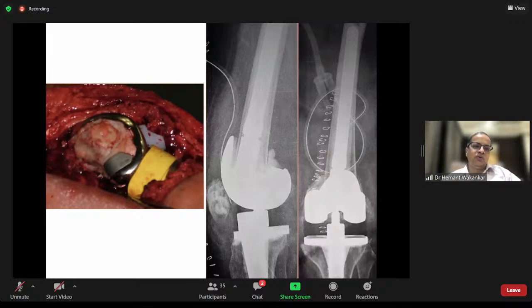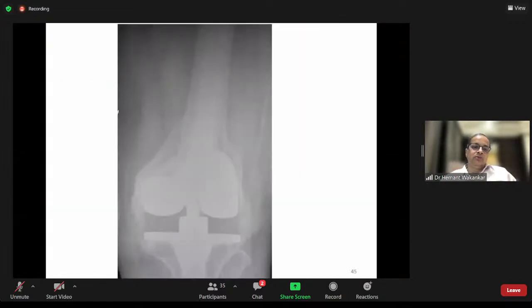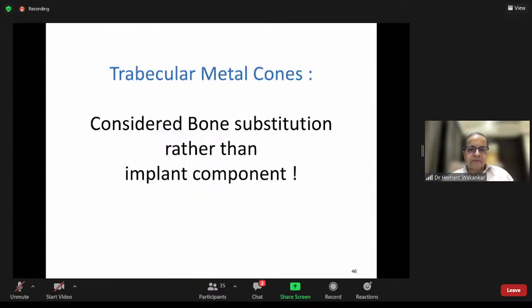As you can see here, I had used 2 femoral heads to reconstruct. This was in fact done almost 15 years back, and we did not have anything else available to us. So only femoral heads were available, which were used. And the femoral stem was fully cemented, again using a rotating constraint prosthesis here. This is almost 4 or 5 years down the line. The patient came for a follow-up, and there was flowing callus that had actually matured, and the patient was able to weight bear and was actually walking on that.